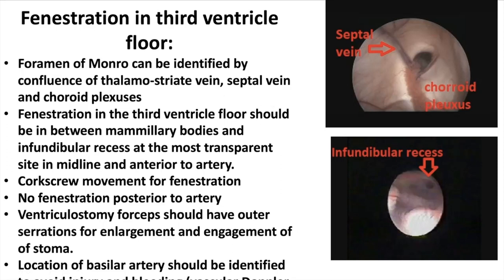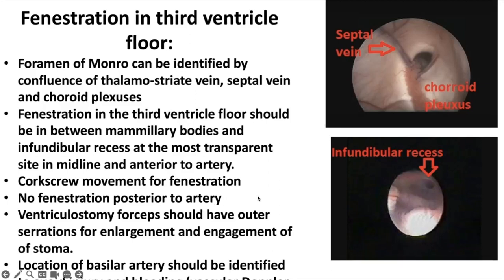Perforation in the third ventricle floor should be between the mammillary bodies and the infundibular recess, at the most transparent place in the midline, and always anterior to the basilar artery or its branches. A Fogarty or corkscrew movement can be used for fenestration. Never perforate posterior to the basilar artery or its branches, as there may be perforators.